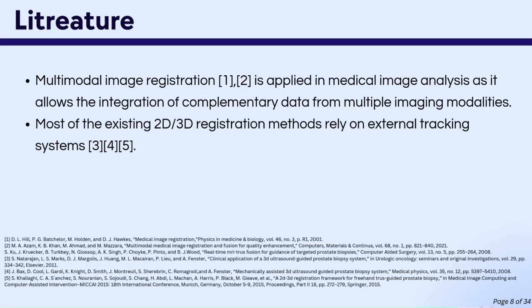Let's look at the literature review. Multimodal image registration plays a crucial role in medical imaging by integrating complementary data from diverse imaging modalities. However, most existing 2D-3D registration methods depend heavily on external tracking systems.